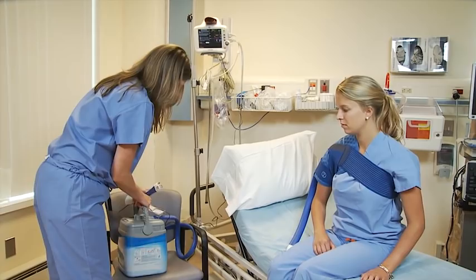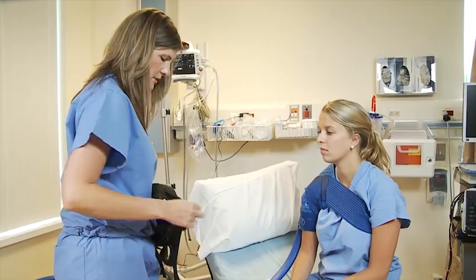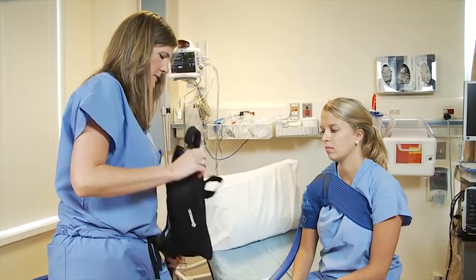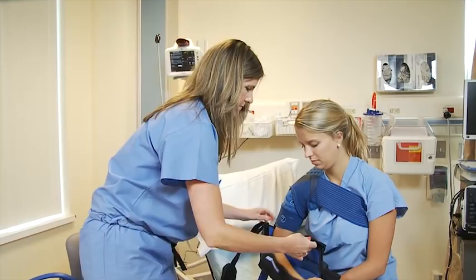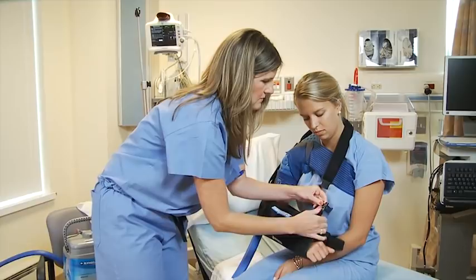So normally when you go home with ice therapy, you're going to be typically in a sling. I just want to give you an idea of what the whole thing's going to look like together. You can open the sling right up like this — slip your arm in to the very rear of the sling, elbow to the end. This strap is going to go around your shoulder, around your neck, and clips in place like this. Use this little strap to keep this when not in use, right in place so it's not hanging. That's typically what you're going to be sporting.